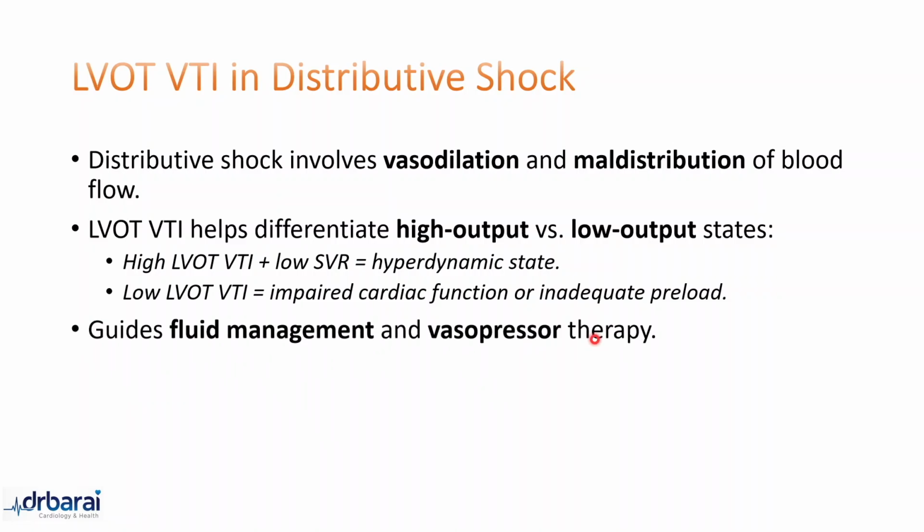Like in the case of hypovolemic shock and sometimes in cardiogenic shock, distributive shock can be affected by the LVOT VTI during fluid management and vasopressor therapy.